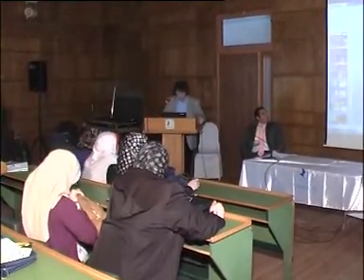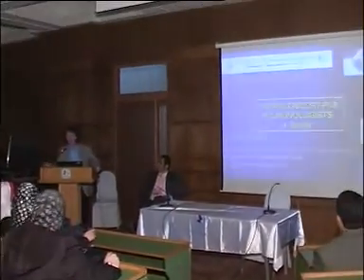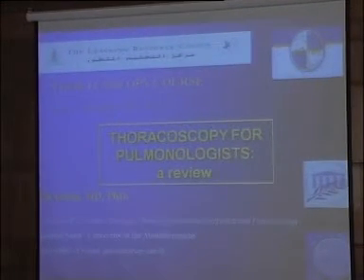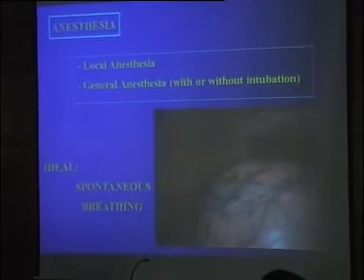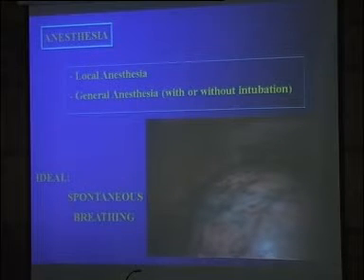Okay. Then you will start thoracoscopy very soon, I hope. What you have to know is the basic approach of medical thoracoscopy, pleuroscopy. The definition is not so important for me, but we can discuss this point. The first point is anesthesia. It's simple. It depends on your facility.